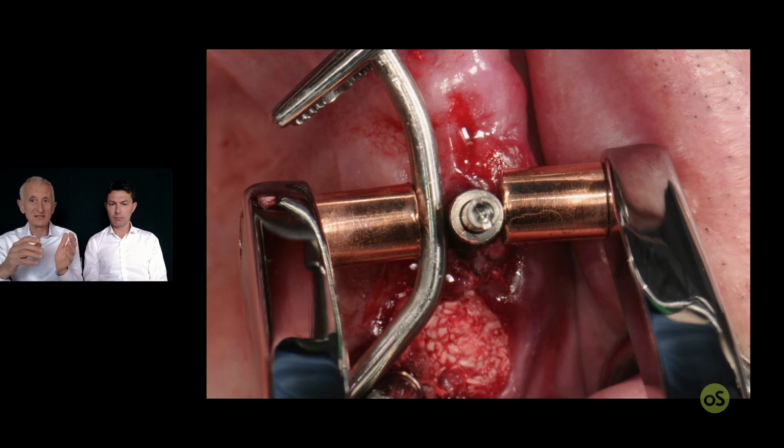Otherwise, you will have a problem because in the next steps you have a distance between the wire and the abutment. So release the clamp, have a look. If the wire is passively resting against the abutment, you can move to the next step. If it is not, put down the clamp, grab once again one of the pliers, bend the wire a little bit until you are in contact.